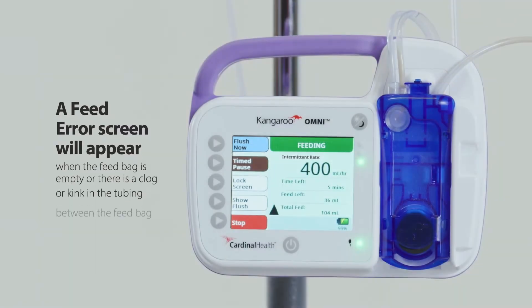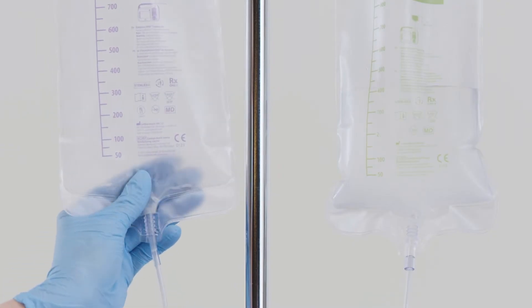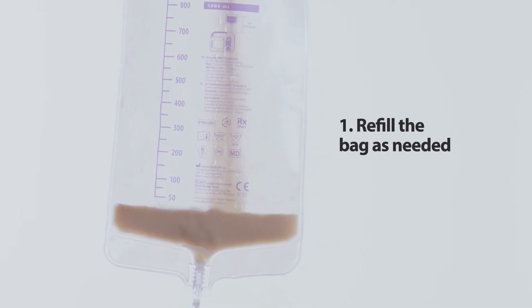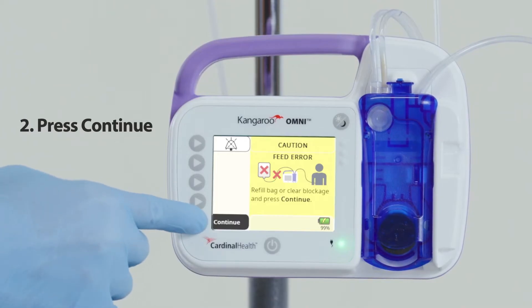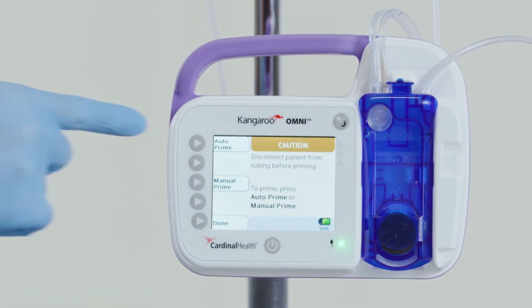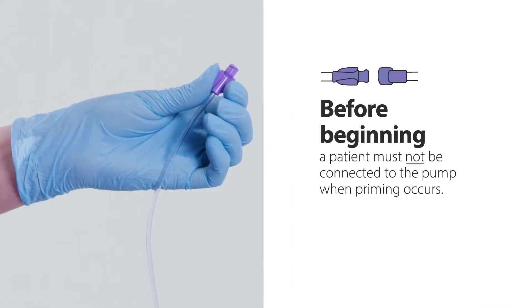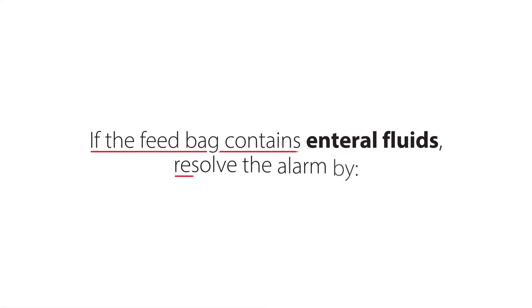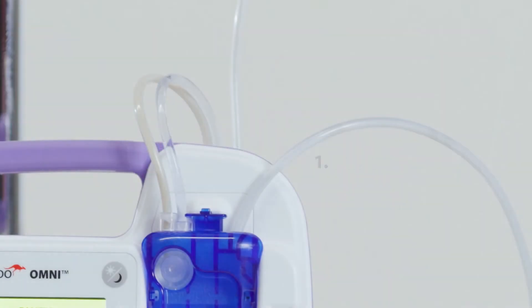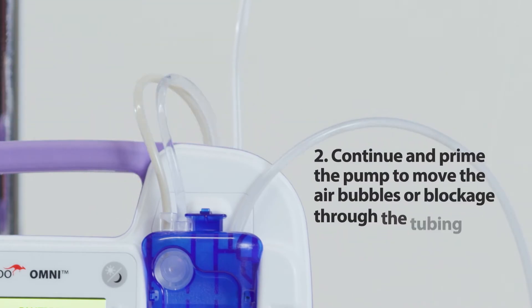Feed error alarm: a feed error screen will appear when the feed bag is empty or there is a clog or kink in the tubing between the feed bag and the pump. To resolve the alarm, first check to see if the feed bag is empty. If the feed bag is empty, refill the bag as needed, press continue, then prime the pump for the next feeding. The patient must not be connected to the pump when priming occurs. If the feed bag contains enteral fluids, check the tubing between the feed bag and the pump to locate the blockage and clear it if possible.